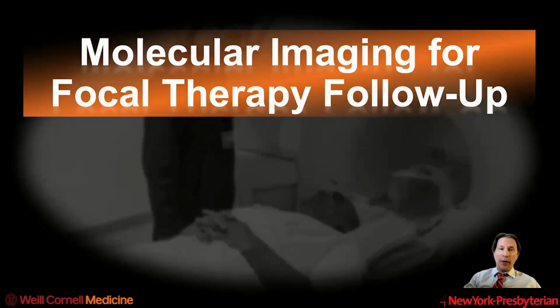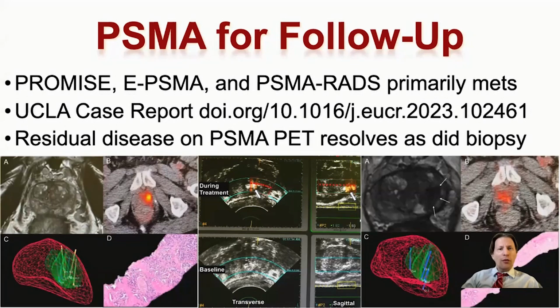And I'm going to talk a little bit about molecular imaging for focal therapy follow-up. So there are 3 standards for evaluating PSMA PET. While they are TNM based, it's the N and the M that are emphasized, as they rely primarily on evaluation of metastases: PROMISE, ePSMA, and PSMA-RADS. Also, there was a case report from UCLA where PSMA PET was used to guide treatment, and there was concordant absent PSMA activity and absent cancer on follow-up biopsy in this case.